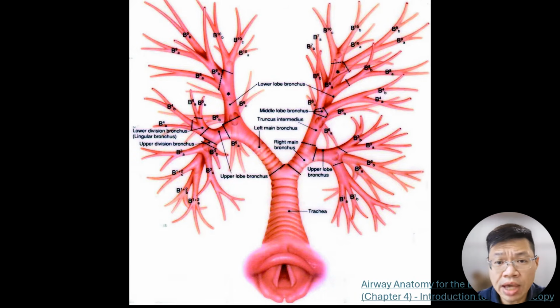As mentioned, even though the airway may seem like a complicated network of tunnels, every path through the airway is linear as the airways are lined up in series. If the X were to represent a nodule, the path that we take from the vocal cords to the airway, as you can see, even though it may traverse a complicated network of branches, is essentially a straight and linear path.